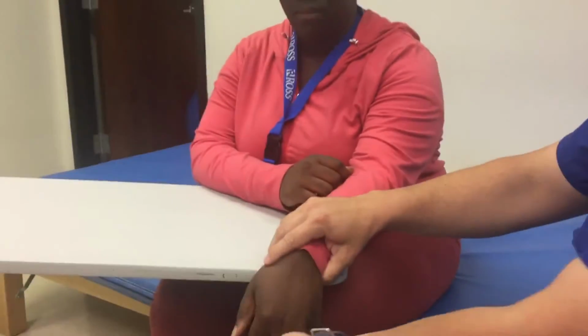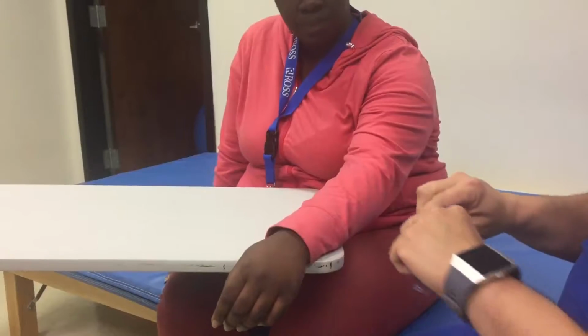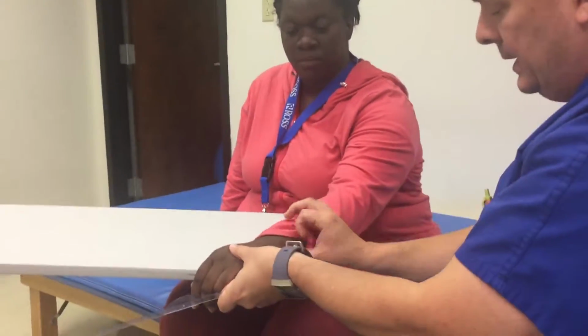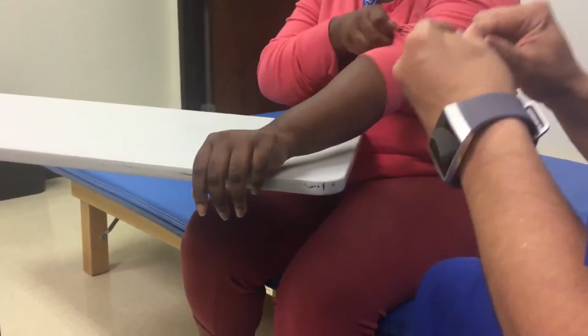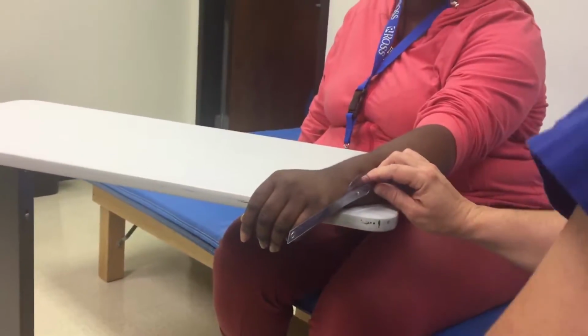To be able to hang off, because she needs to be able to do this. Okay, so the axis of rotation is going to be right distal to her ulnar styloid process, right?